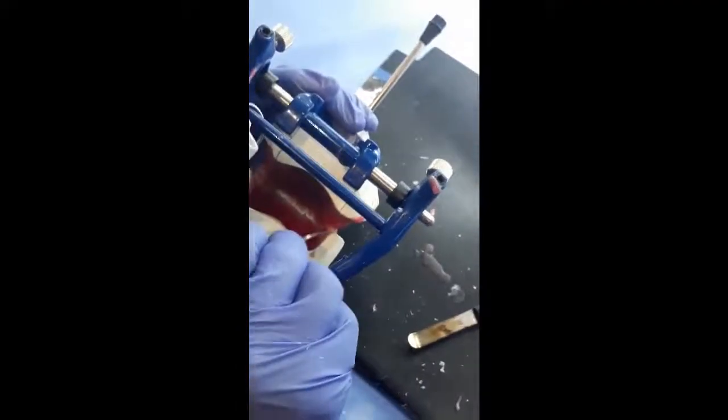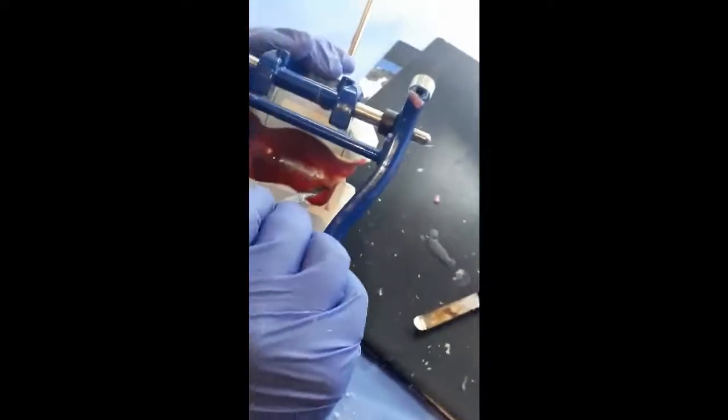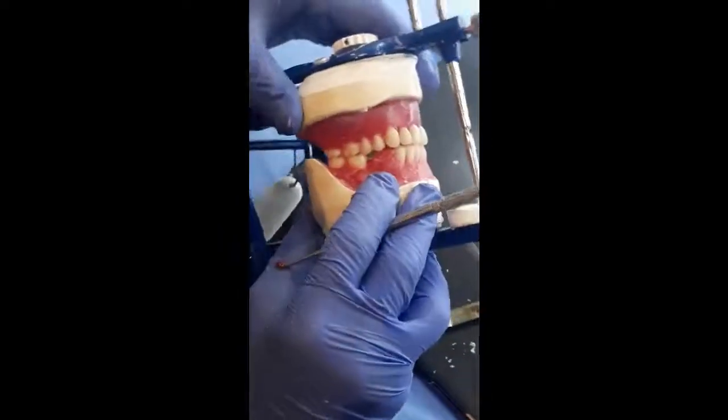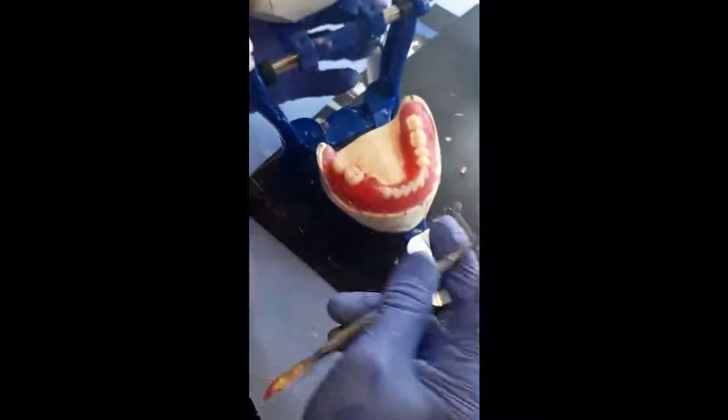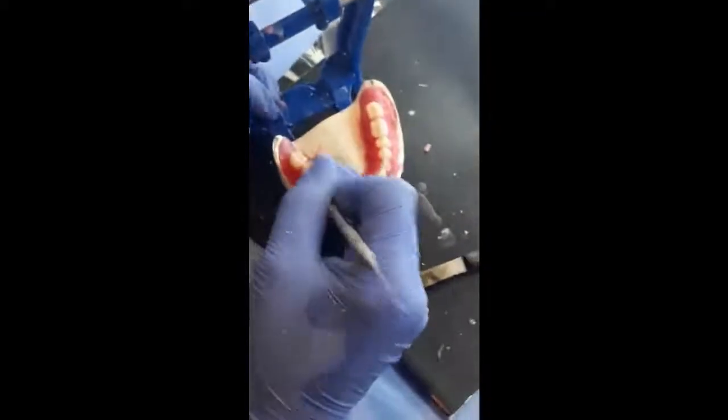The palatal cusp of the maxillary second molar must articulate with the central fossa of the mandibular second molar. So the intercuspation will be effective for the patient.